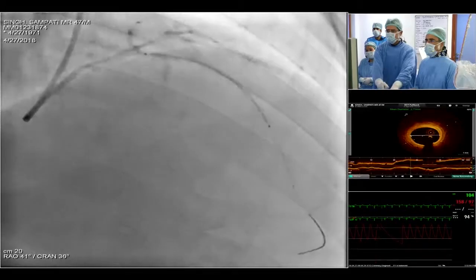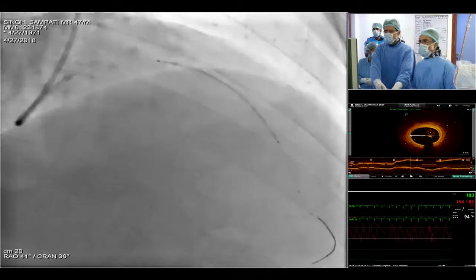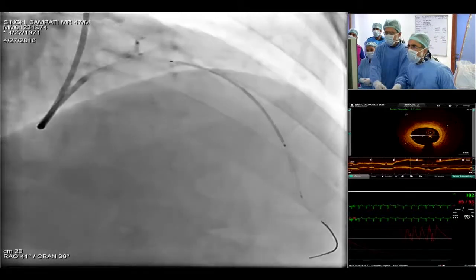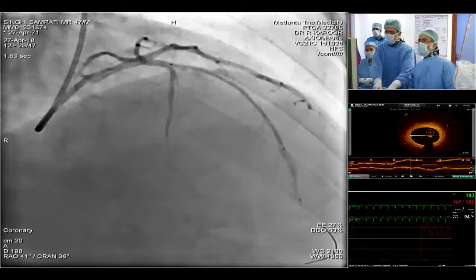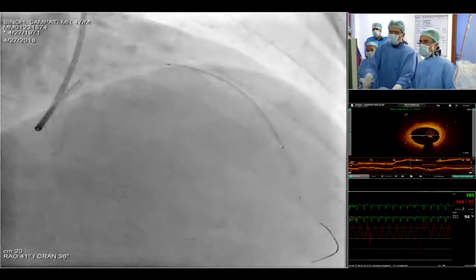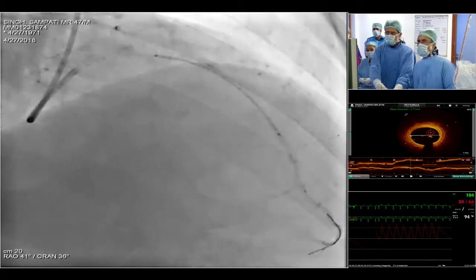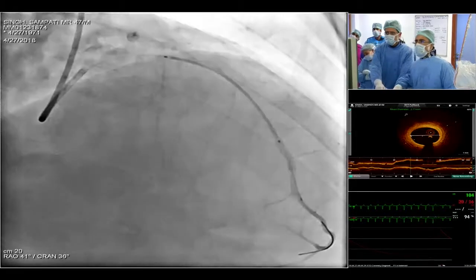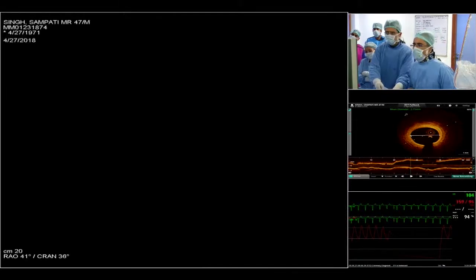Check. The overlap will happen, let's see. Check. Just touching, we need to come forward a bit. Can we come back? I think you should reply here. Come back a little bit. Check. Distal is fine. So this is the best position we can achieve. Just go forward slightly. We can't go forward, so it has to be done like this.